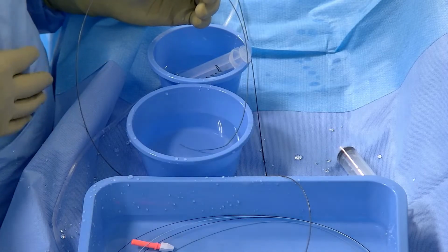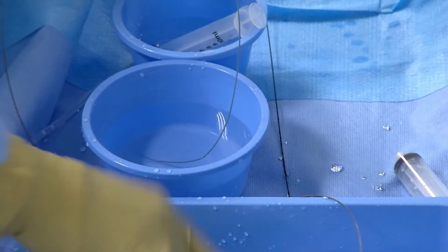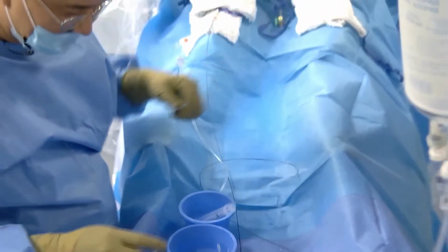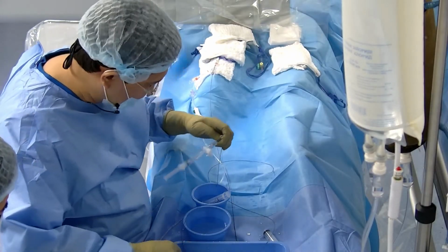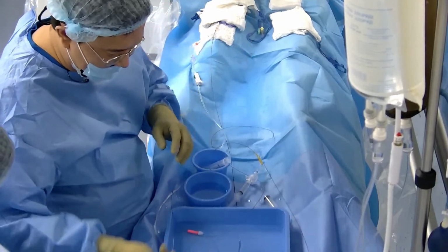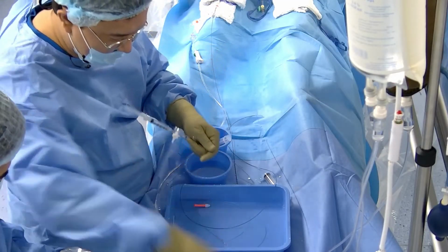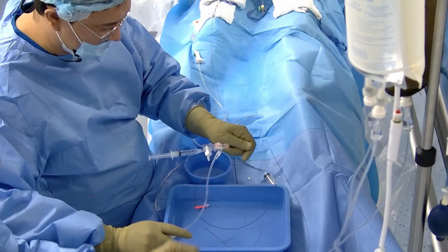Yesterday we did one of the last cases, and we tried to show the anchoring technique, and during the anchoring technique we inflated the balloon on the cervical ICA in the Petro segment. It's a proper preparation of the instrument. Most of the time I'm lazy. I'm trying to avoid additional steps. That's why I'm just preparing. I'm looking for the balloon.